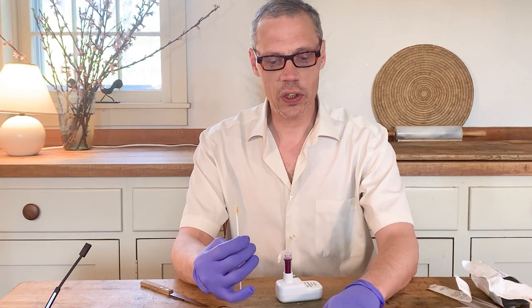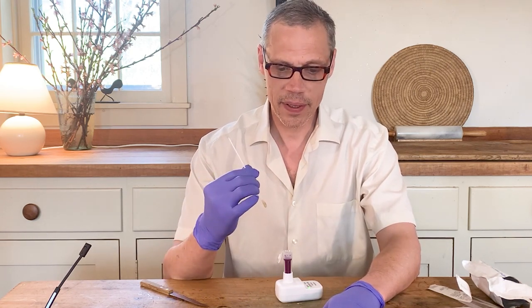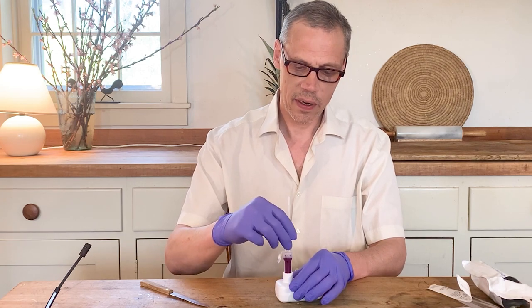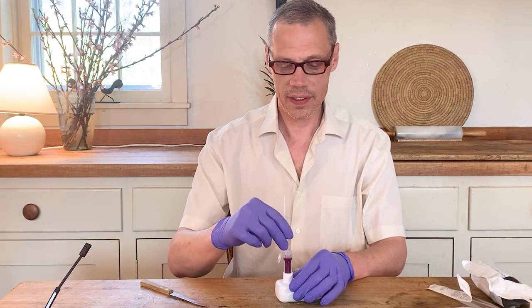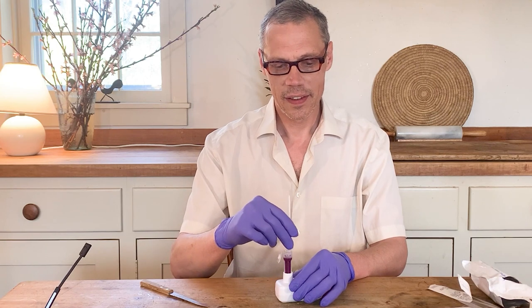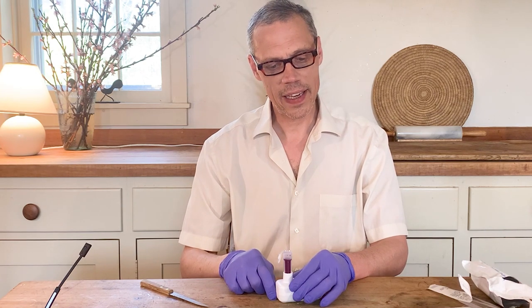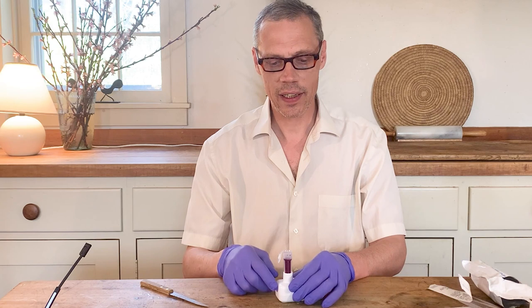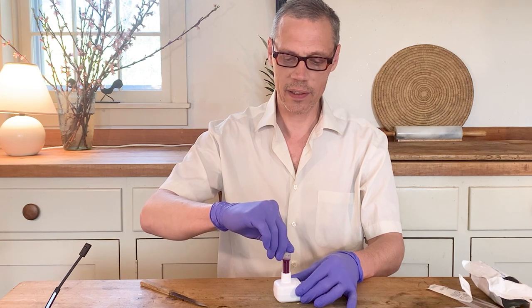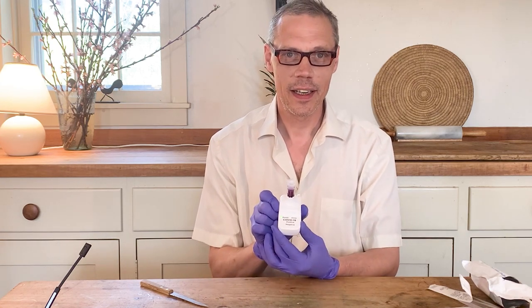Step three: stir swab and run test. Insert the swab into the vial until it touches the bottom. Mix the sample by stirring it around 15 times. One, two, three, four, five, six, seven, eight, nine, ten — this is pretty easy, I think almost anybody could do this. Discard swab. Snap cap closed and push it down until you hear a click and the thing starts to blink. The little light will begin to blink and let you know that you did it right. Close and snap — success! Blinking light.